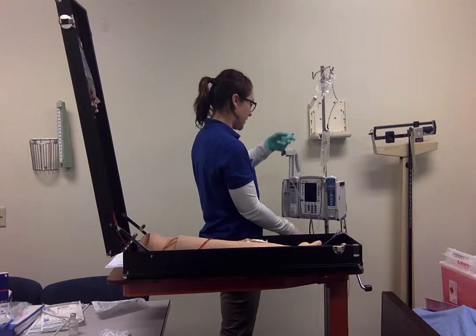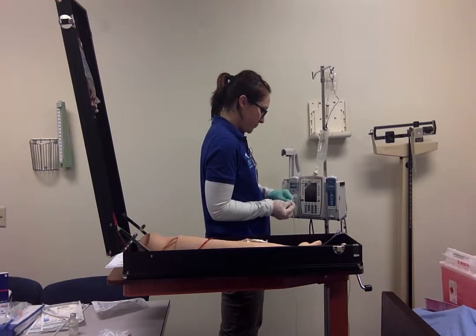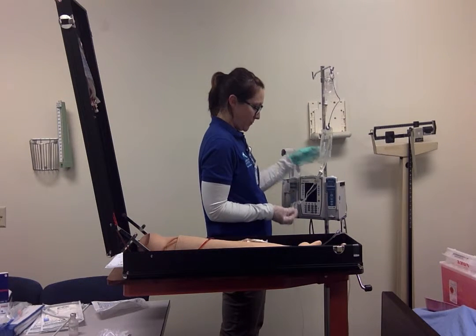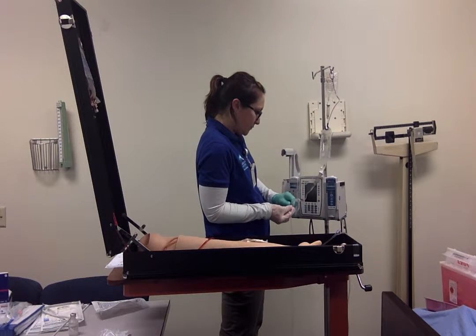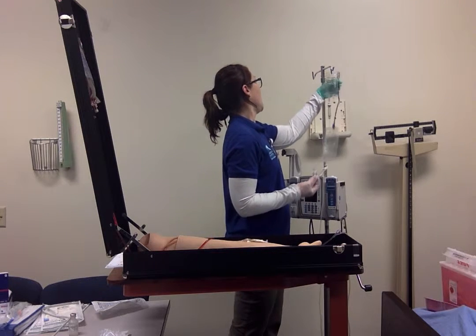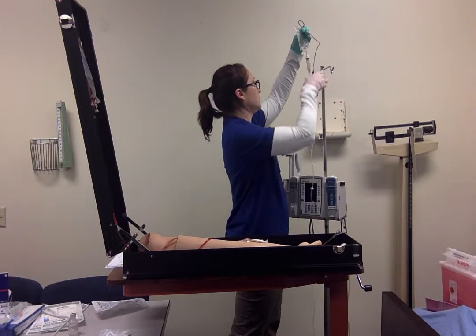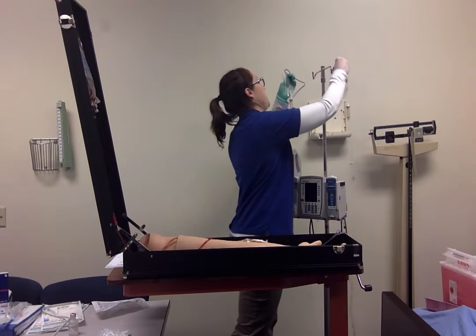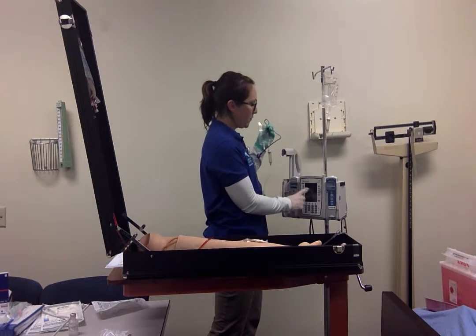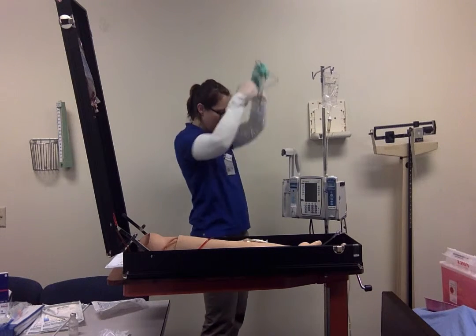So first I need to disconnect this, I believe. I'm going to clamp it down. Then disconnect. Setting that aside. And go ahead and take the old one down. And rehanging my primary. I need to make sure that I put in the primary drop factor as well, making sure that's up to date. I can dispose of this.